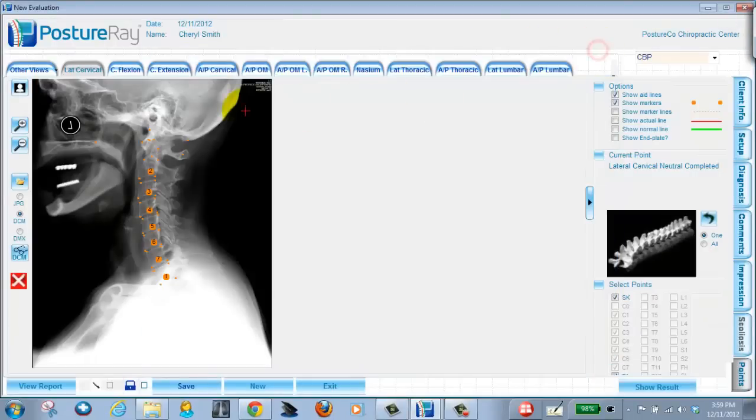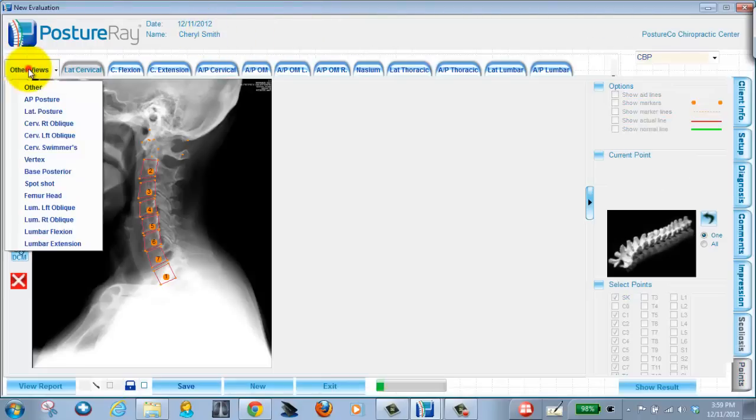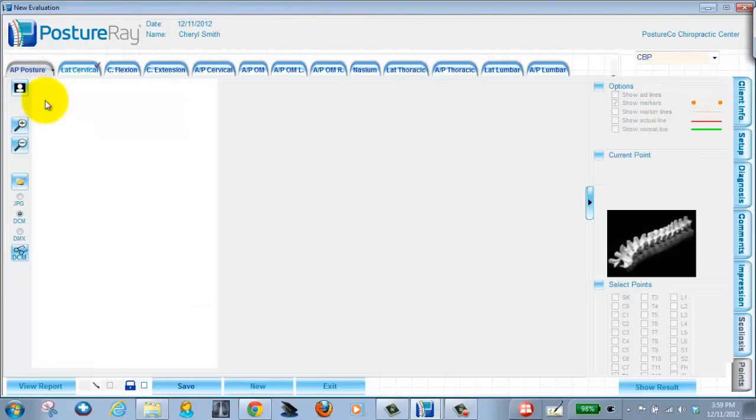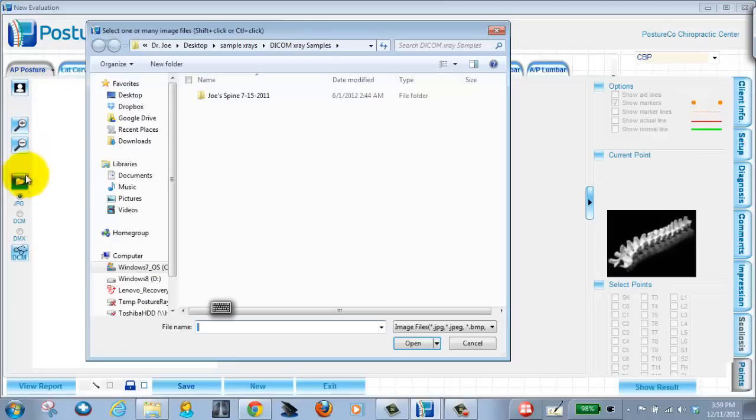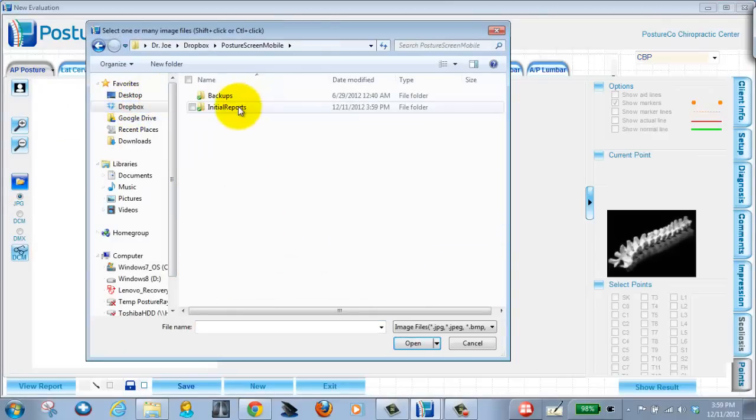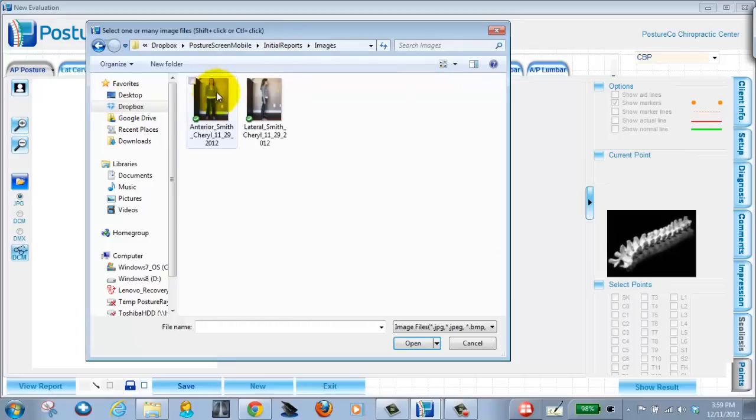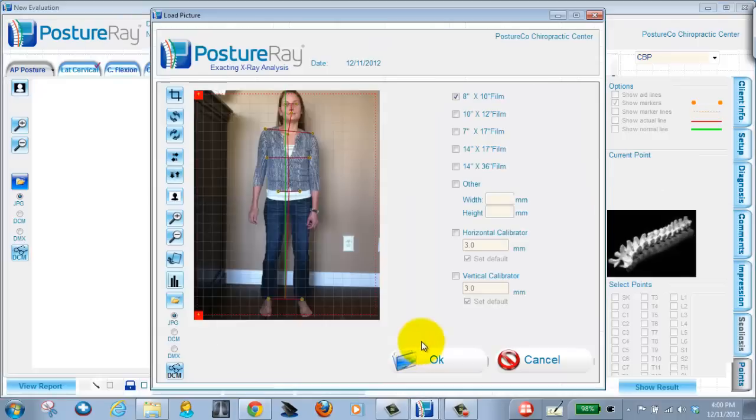All right, but how do I pull this into Posture Ray? Well, quite simple. You open up the patient's account, you go into other views, we go into AP posture. Now we're in AP posture and all we do is choose JPEG and I'm going to browse to Dropbox. I'm going to go into Posture Screen Mobile, initial reports, images, and then I click the AP exam and then I just hit OK.